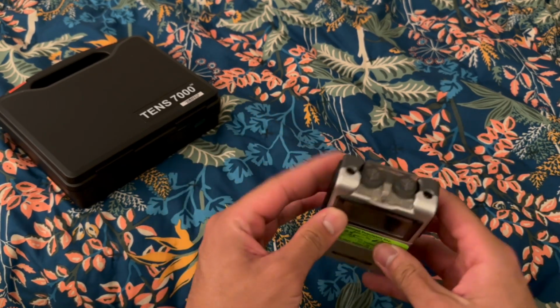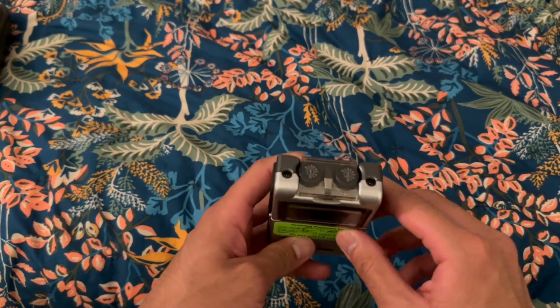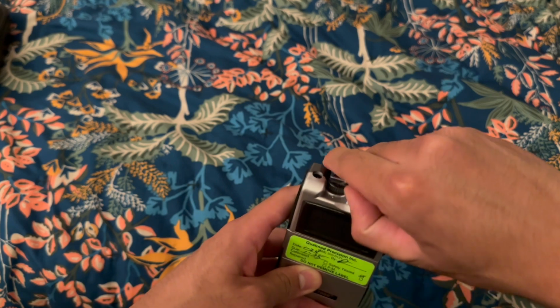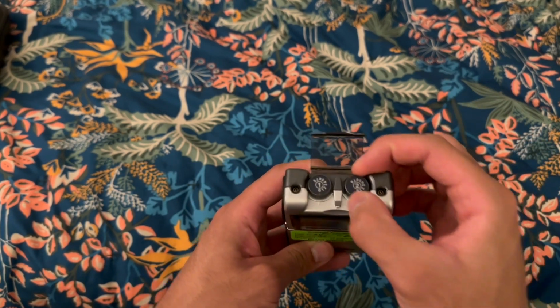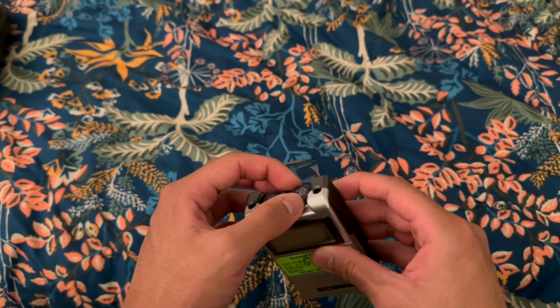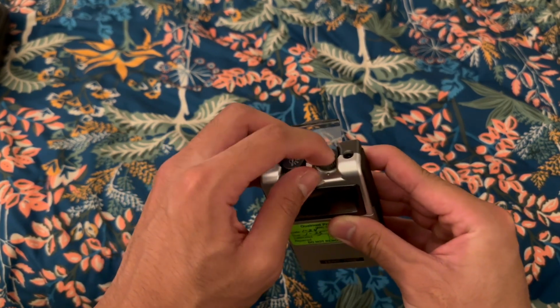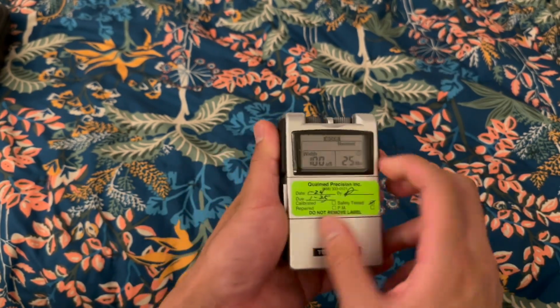Slide that cover. Now that the battery is in, we can turn the unit on by lifting this cover and twisting the knob. This is our intensity knob, and we'll touch more about that later, but this is pretty much how we turn it on. We'll twist it. You hear an audible click and also an audible beep.